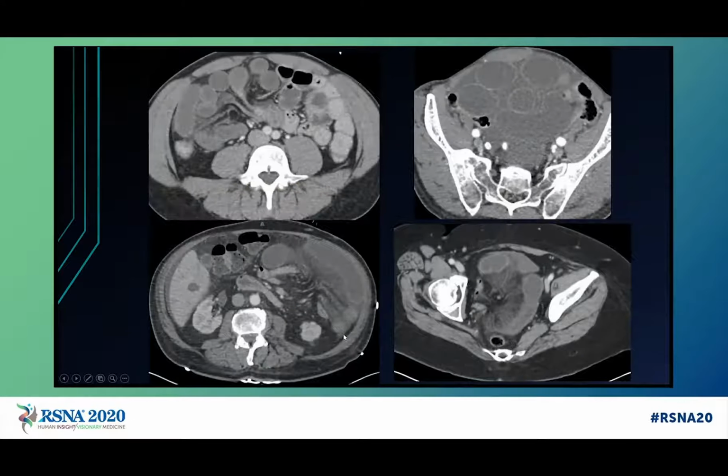Here is a collage of 4 different patients with varying segment lengths of closed loop small bowel obstruction. Again, notice that they have this clustered appearance. Some people have described this as a bag of bowel, where they look abnormally separated from the rest of the GI tract. Look for the inlet and outlet at the same spot, at the same transition point for obstruction. Look for signs of hypoenhancement, mesenteric edema, and bowel wall thickening, complicating these as they are at increased risk for ischemia.